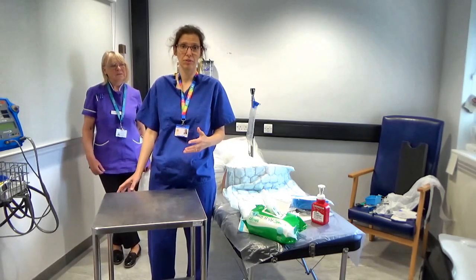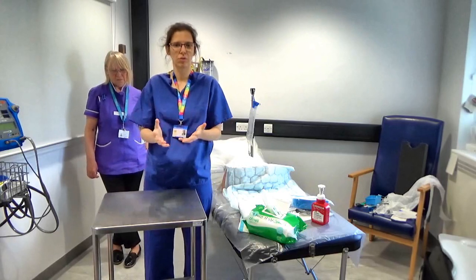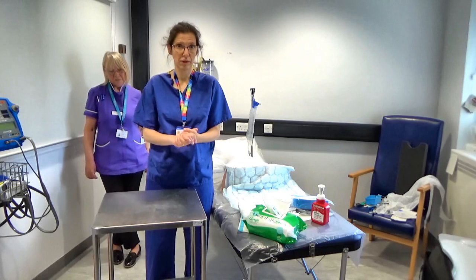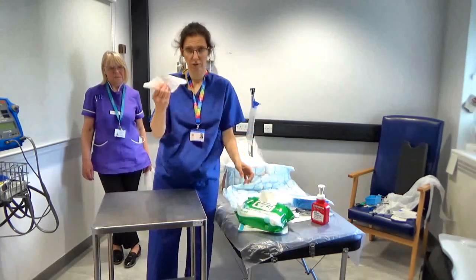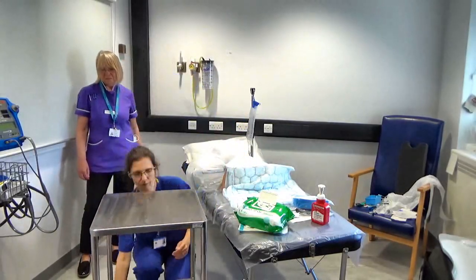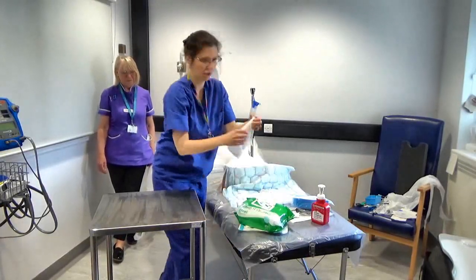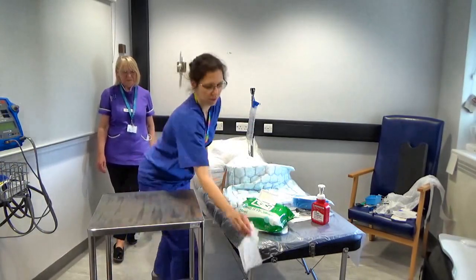First of all, you need to go away and wash your hands and then find a trolley. Normally in a ward situation or in theatres a trolley would be presented to you, set up and ready. But in some cases you need to find a trolley and clean it. We use clinell wipes for that — take one, wipe the top making sure you get everything and wipe all the sides, then take another one for the bottom. Now you're done and ready to go.